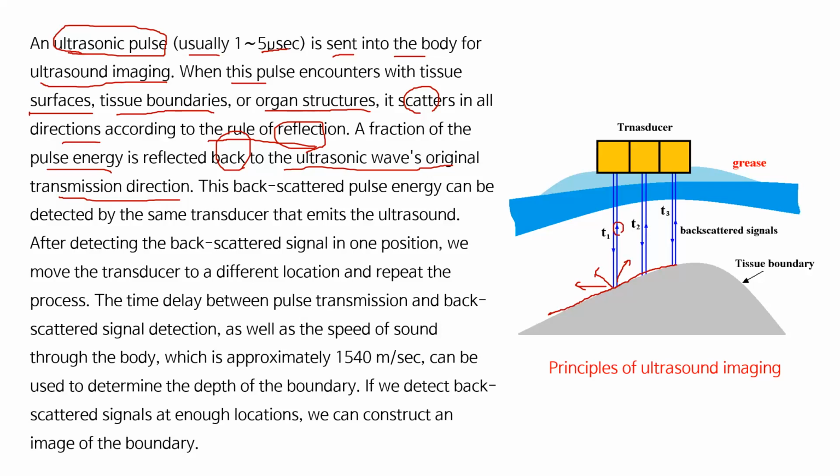This one. So it's going in this direction, and the same direction, the opposite direction, is the backscattered. So this backscattered pulse energy can be detected by the same transducer that emits the ultrasound. So we can measure this backscattered ultrasonic sound wave.